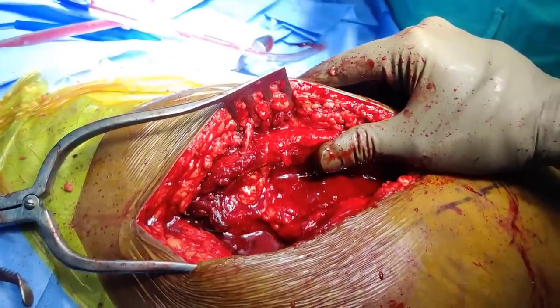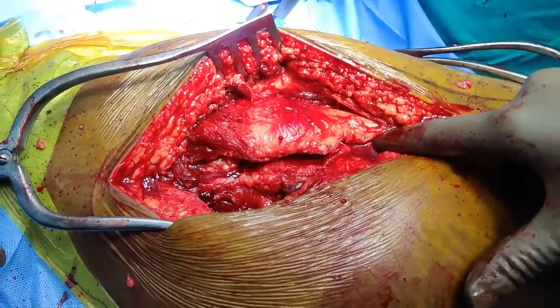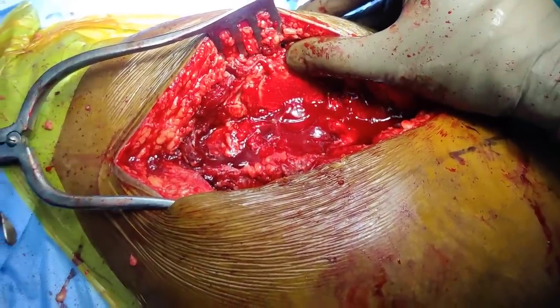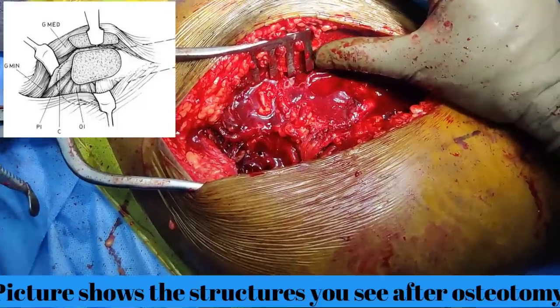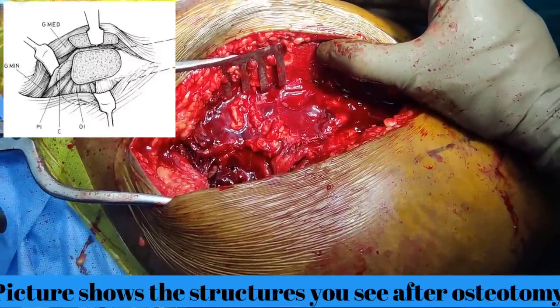This is all lifted. Once you have freed inferiorly and superiorly you will be able to flip this, and it opens like a book. Then you can use a retractor to keep it in the front, and your next step will be to identify the capsule in the front and do your capsulotomy.